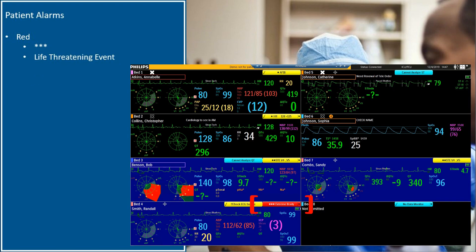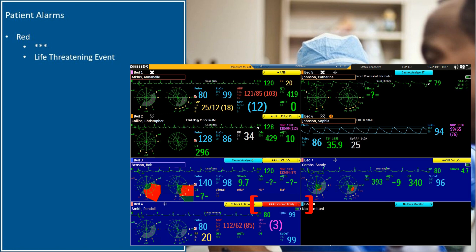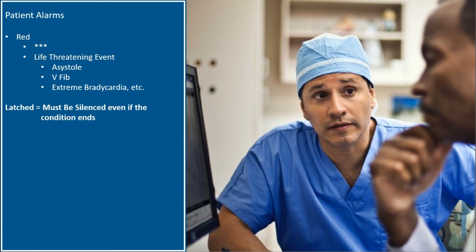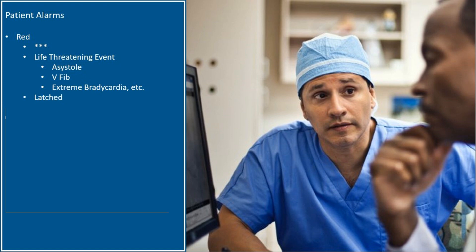When a patient red alarm appears, you will note three stars. This red alarm indicates a life-threatening event such as asystole, V-fib, and extreme bradycardia. Red arrhythmia alarms are latched, which means that they must be silenced even if the condition ends. If the condition does not end, the banner will continue to show even if you try to silence the alarm.